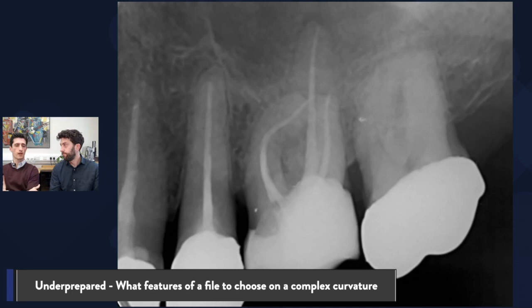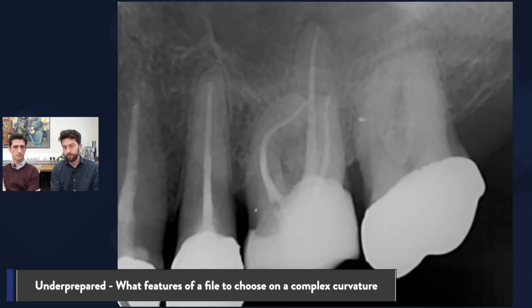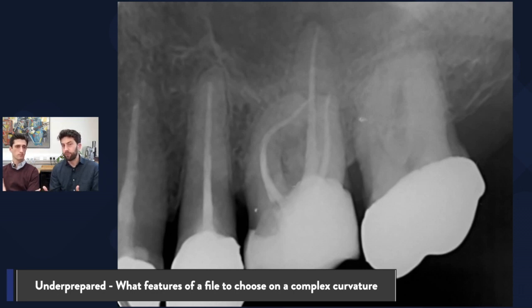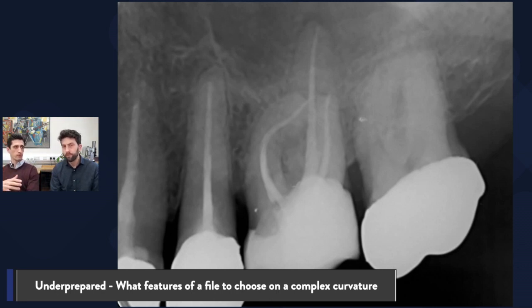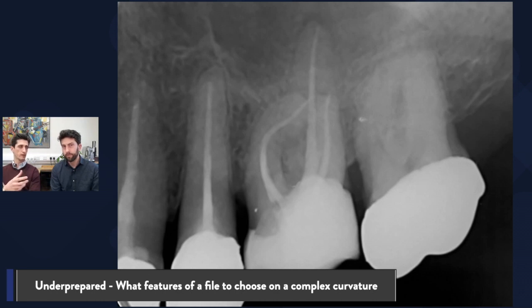I opened with that, then a bit of hand filing with C-pilot files, and I used the purple path file — which is a 13/02 — to bridge the gap between my size 10 and the True Anatomy Glider, which is a size 17/02 variable taper. The preparation here was finished with a 26/04 variable taper, and that's the True Anatomy Prime. So I'm getting a size 25 around that curvature, and there's no way I'd be taking something like an F2 around that. With the reciprocating movement of WaveOne, maybe you could just about do it, but you'd be taking a lot of dentine on that mesial aspect.